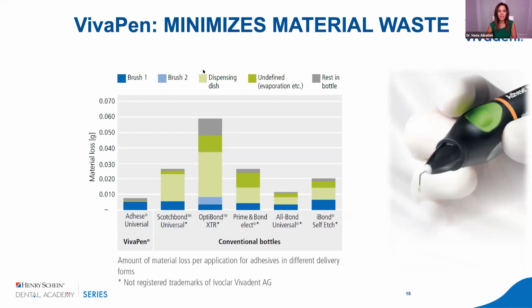And we know that movement of fluid in the dentin is what creates the hot and cold sensations. So the other important thing is when your assistant dispenses a drop of bond from a bottle, you're going to take your brush, dip in, and then place the bond on the tooth. And whatever's left over is going to be garbage, right? So there's a lot of waste of bond typically in dentistry.